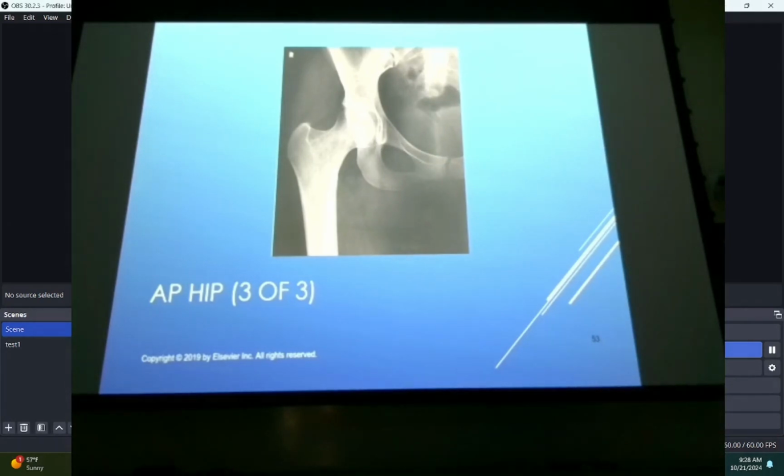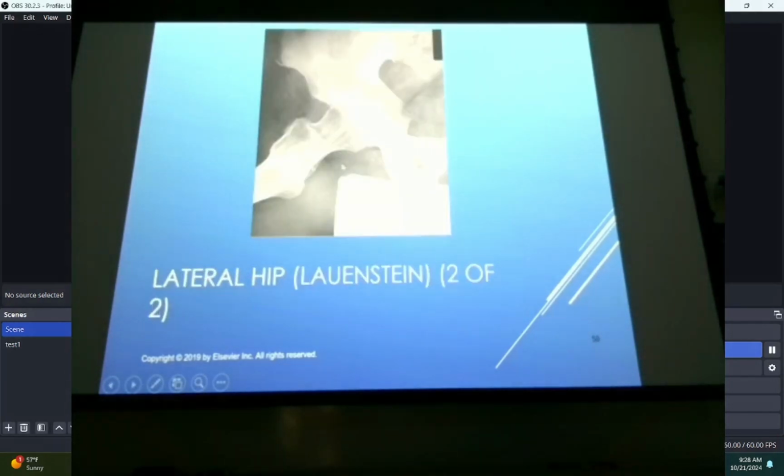You make your exposure and it gives you a readout, which mAs it was. You might want to turn those off and set your technique based on what the AP used. Does that kind of make sense? Pay attention to what it's shot with and just set your mAs based on that. Because if the AP gave you a good exposure, then the frog leg should be shot with exactly the same technique.